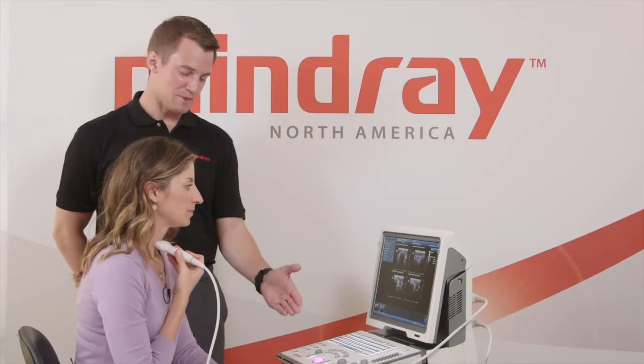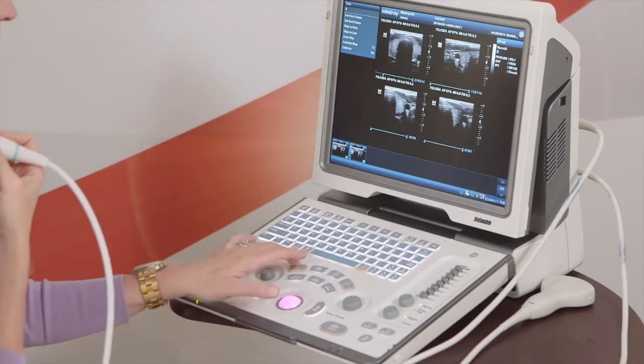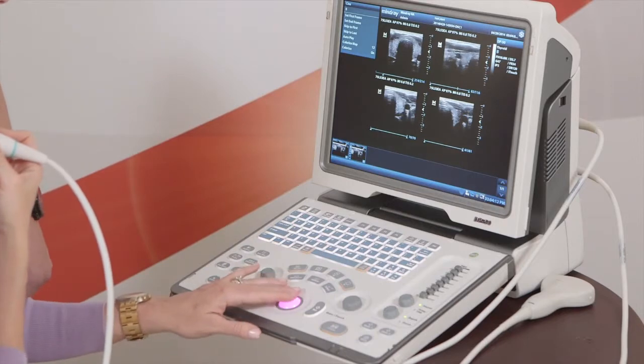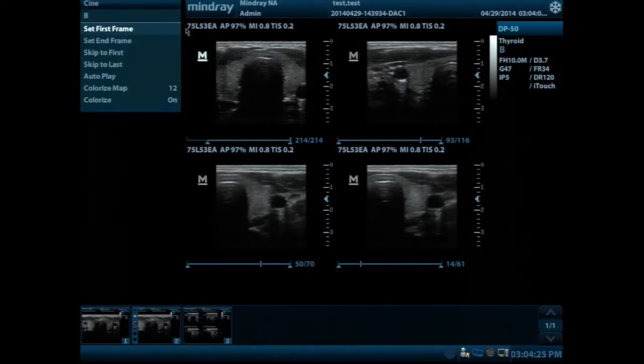And so, similar to dual, when you hit freeze, you can press the quad button and find the right image that you want, using the trackball in the Cine Loop mode, going back and forth. Nice. And when you freeze again, you'll go out. I could take that if I wanted to. You could, absolutely, yep. So you hit save 1, which again saves the still image.